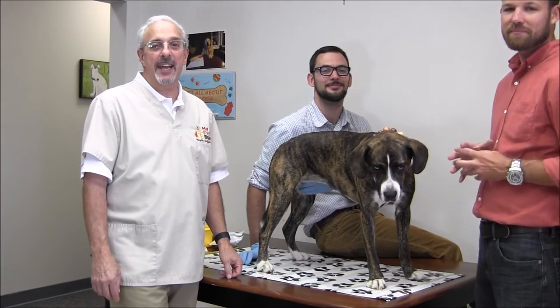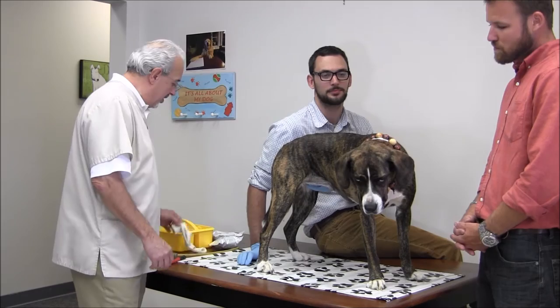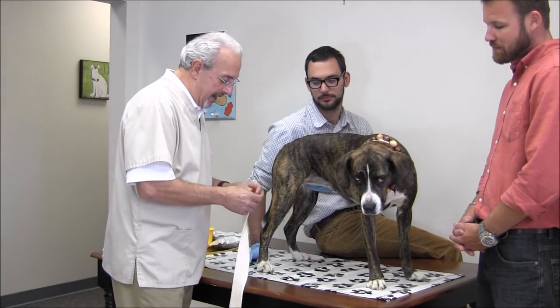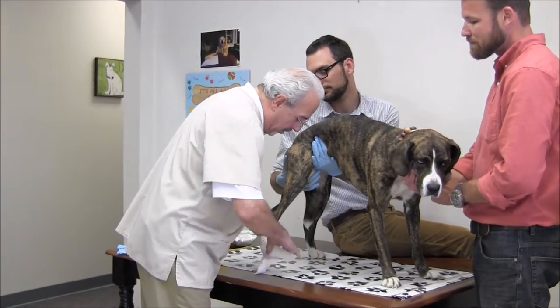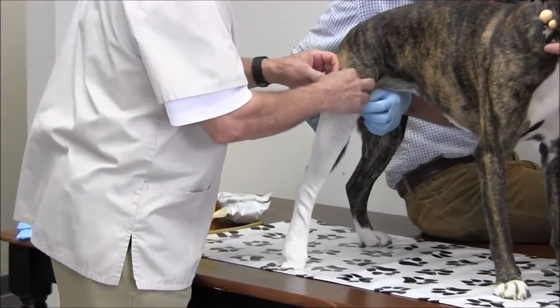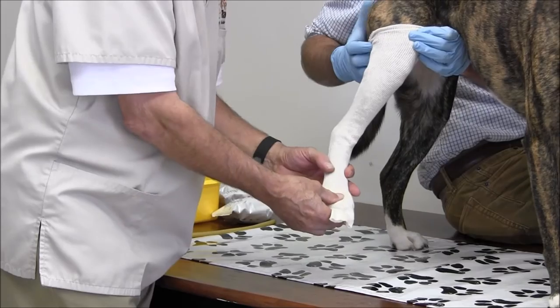Hi, I'm Jim Olimo and today we're going to take a cast of a hock paw brace. First of all, we're going to take a stockinette and put it on the dog's leg — your helper can help hold up the stockinette. We're going to have the stockinette come just above the knee and include the entire paw.